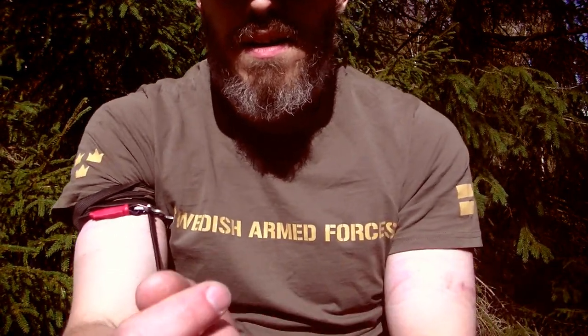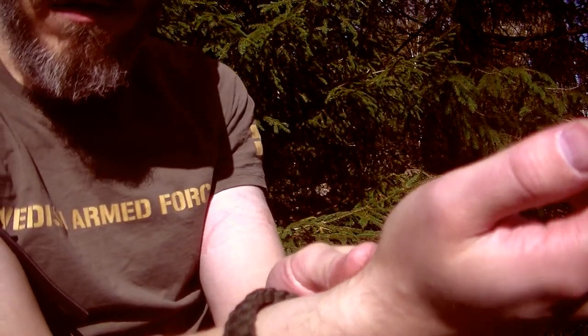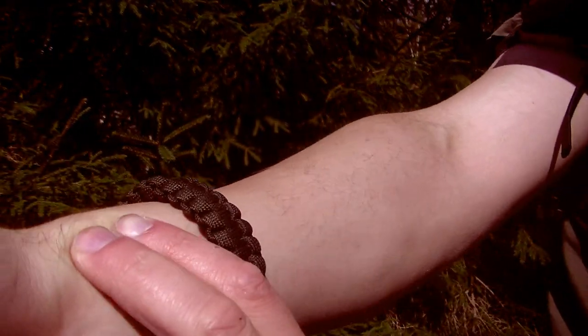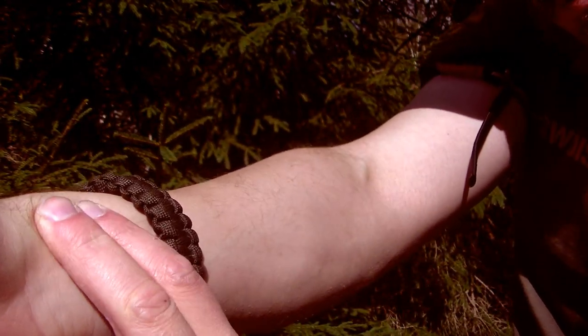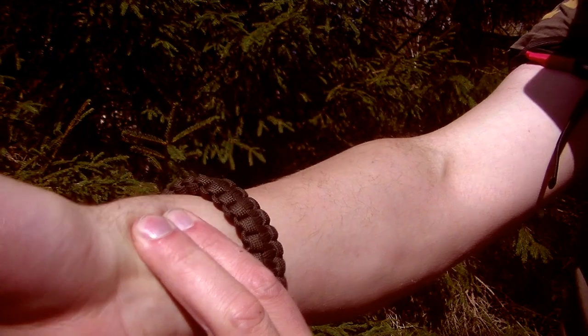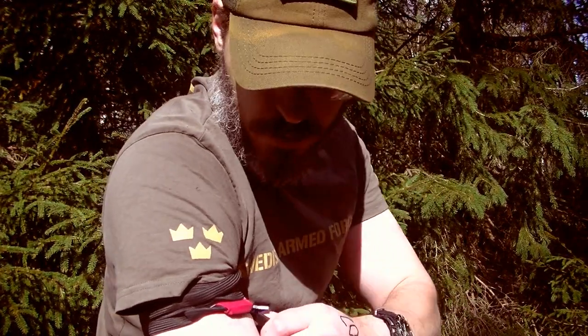I was checking my radial pulse — it's always on the side here. You should check it before putting the tourniquet on so you know where you have it, and then check it afterwards. In this case I don't have a pulse because I've cut off the arterial blood flow with the tourniquet.